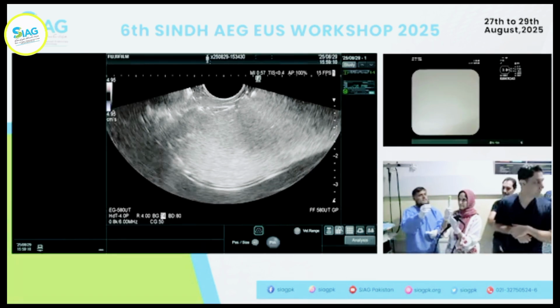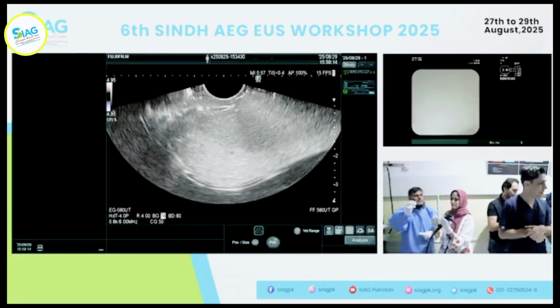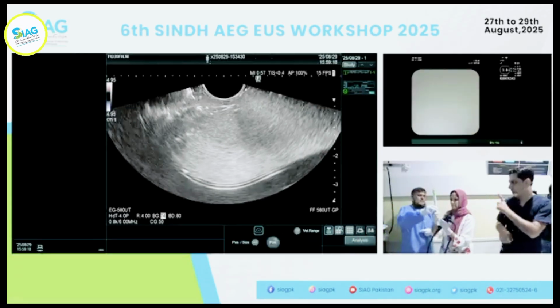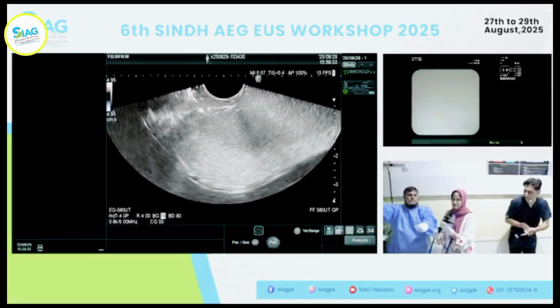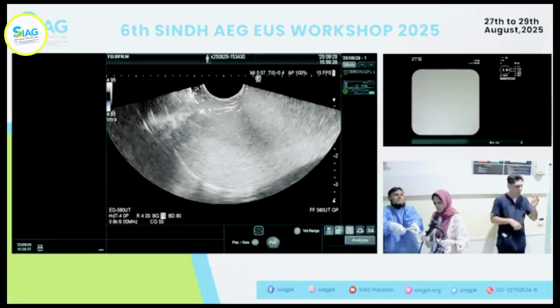Good. That's it. So heparinized needle, medical liver biopsy, heparinized needle. You don't need a stylet, intermittent suction. Going in, you don't need a Doppler, but going out, you definitely need a Doppler.